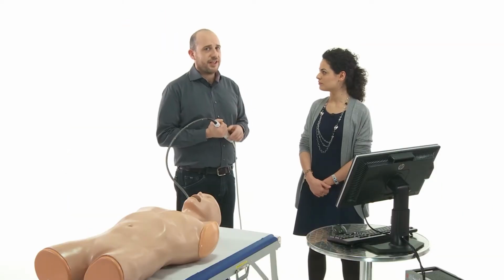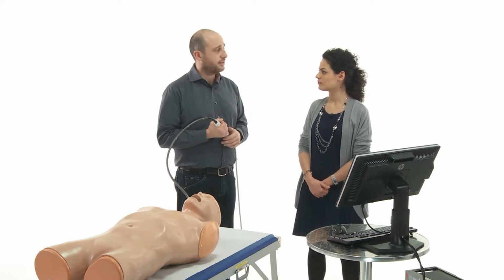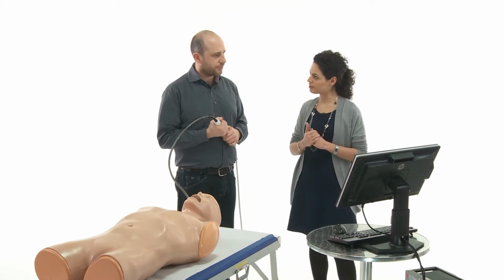Do you always do like this, Bruno? And it's not so easy to perform such a complete examination in the intensive care unit. Normally, we examine the aorta only in a patient who received an operation on it, or if we have a suspicion of a new pathology of the aorta. But I would suggest for all cardiac anesthesiologists to examine the aorta in every case in the operating room. And which views do you need to really scan the aorta?